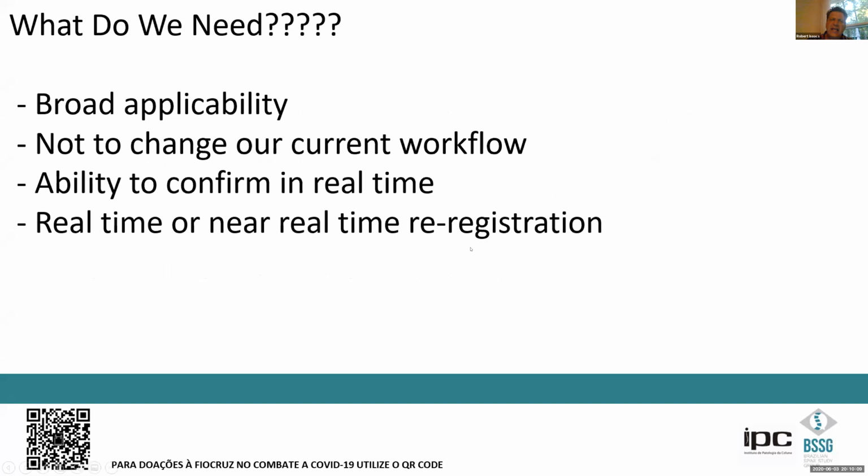And so when you think about what we need, I'm not sure we need someone to hold our hand, but what we need is broad applicability. When you look at what people are using these technologies to do in other fields, they can do a lot. And there are surgeries that are effectively only able to be done, or certainly only able to be done as well, with the use of robotics. We're not there yet with spine.